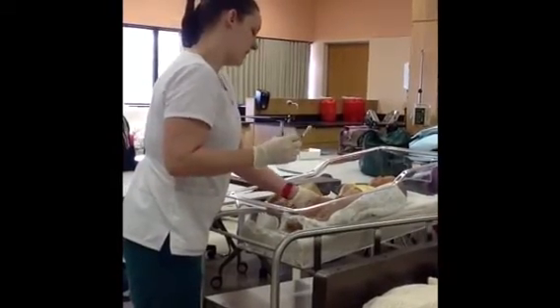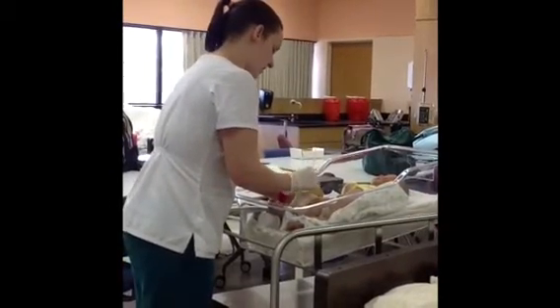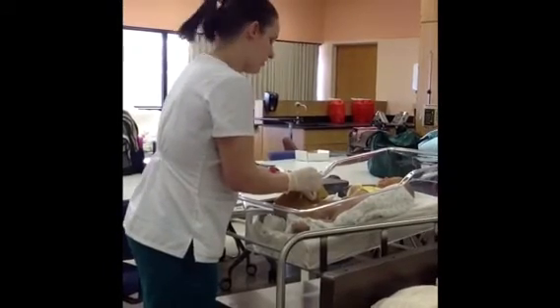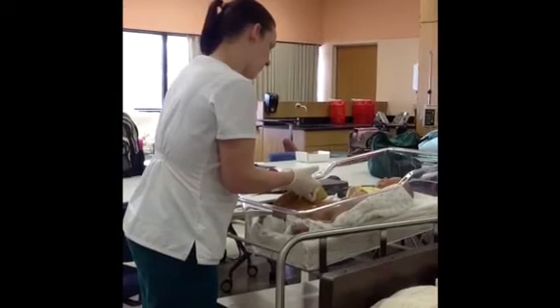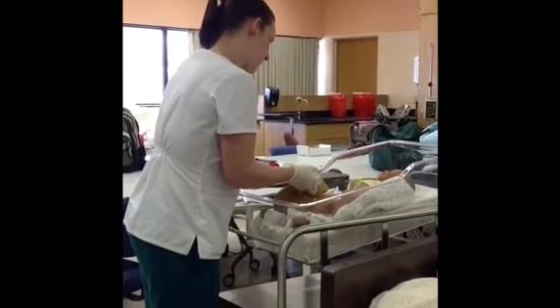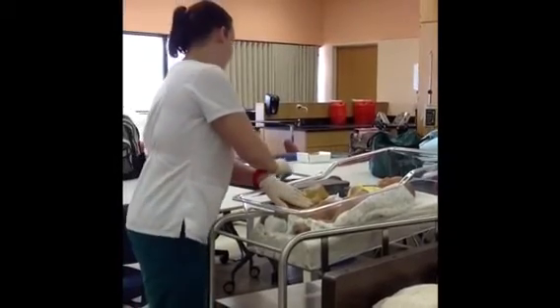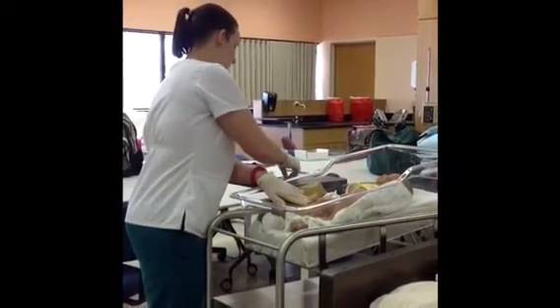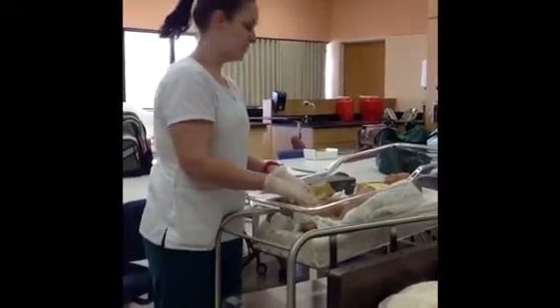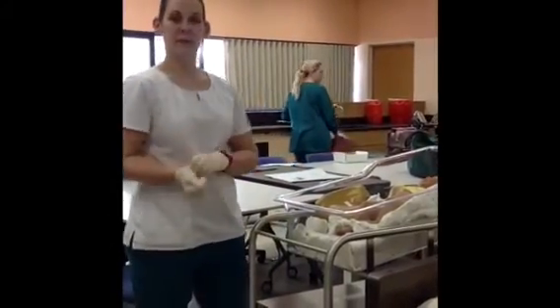I would grasp the baby's leg, stabilizing the knee and the thigh. I'm not going to inject into this baby, but I would inject in, aspirate a small amount just to make sure there's no blood return. There's not, so then I will inject the medication. I'll remove the needle and cover it with a little bit of pressure with the alcohol swab. Not massaging, just holding it here. I'll watch the baby to make sure there's no type of reaction. I'll document the whole procedure, wash my hands, remove my gloves, and throw them out.